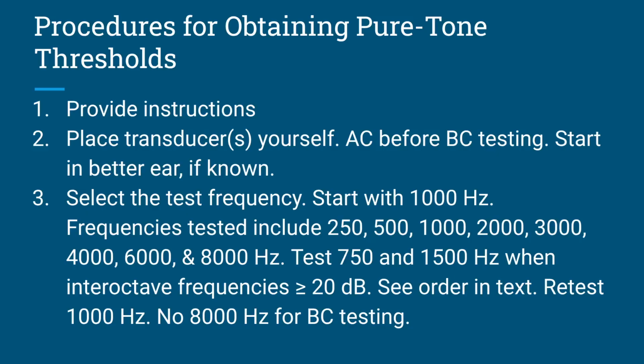So after you provided instructions, you place the transducers, typically yourself, although there is research to show that patients can place the transducers themselves and have accurate results. I mean headphones, I don't mean insert earphones. You do air conduction testing before bone conduction testing, and you start in the better ear if known. If you don't know the better ear, you start in the right ear. Why the right ear? Just because you have a standard.